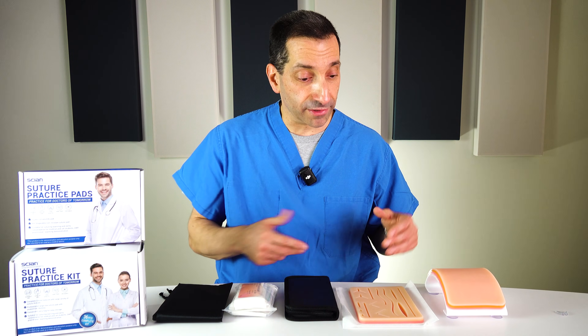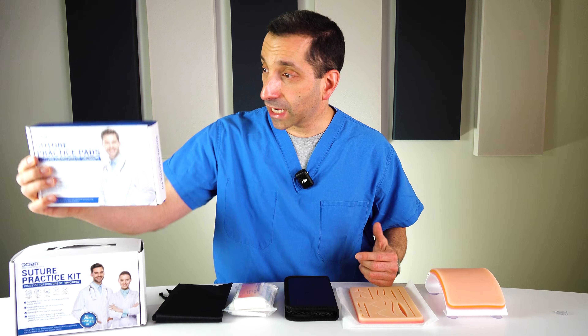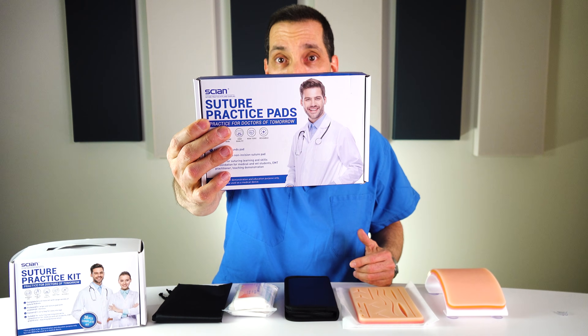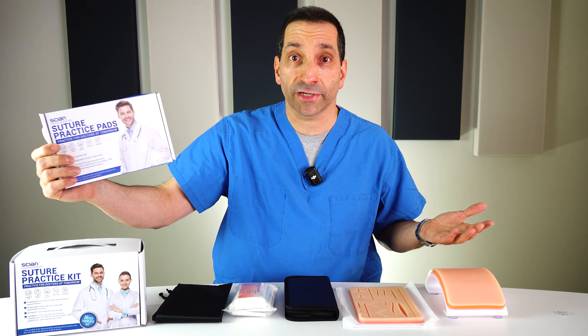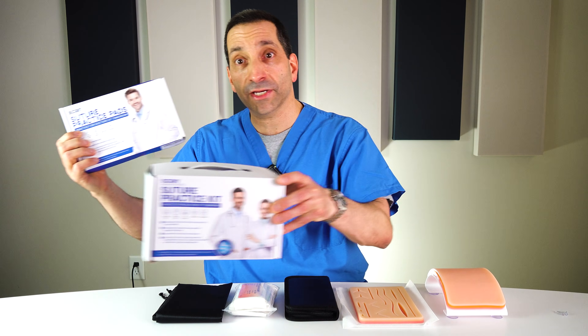When students come to the classes now, they bring a version of one of these kits to learn on. Sian, the company here that sells several of these kits on Amazon, wrote to me and asked if I'd like to check some of their kits out. I said I'd love to, so they sent me two of their kits.